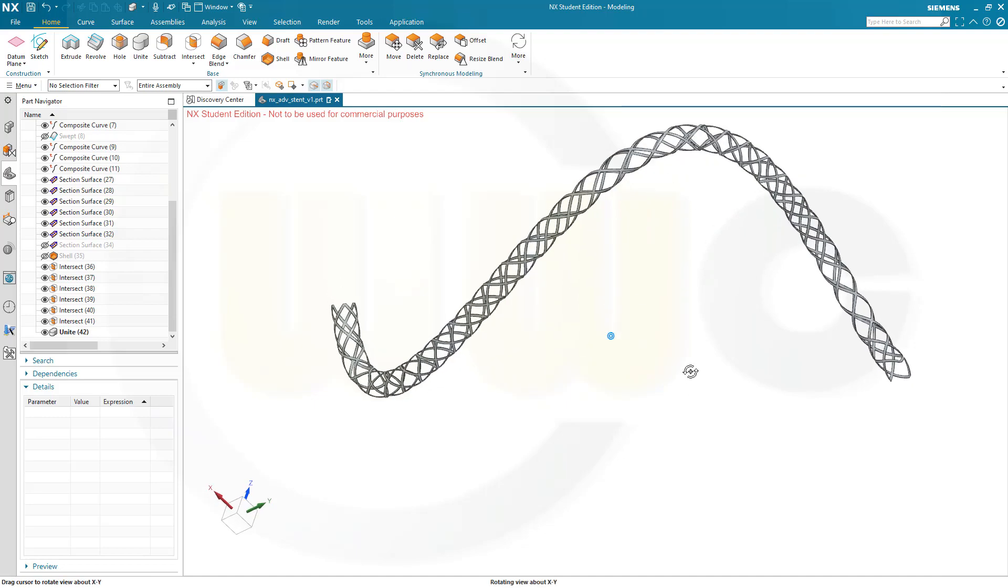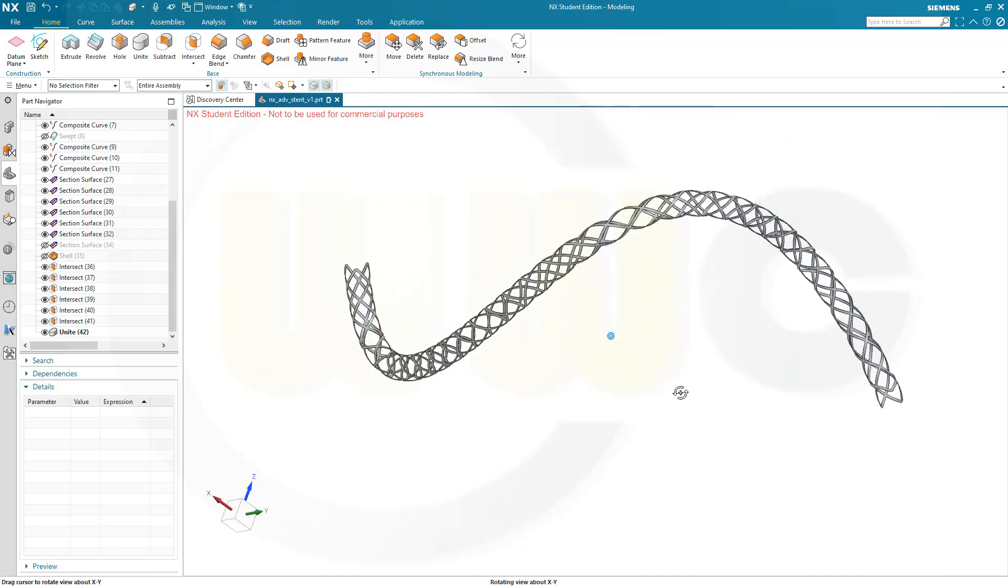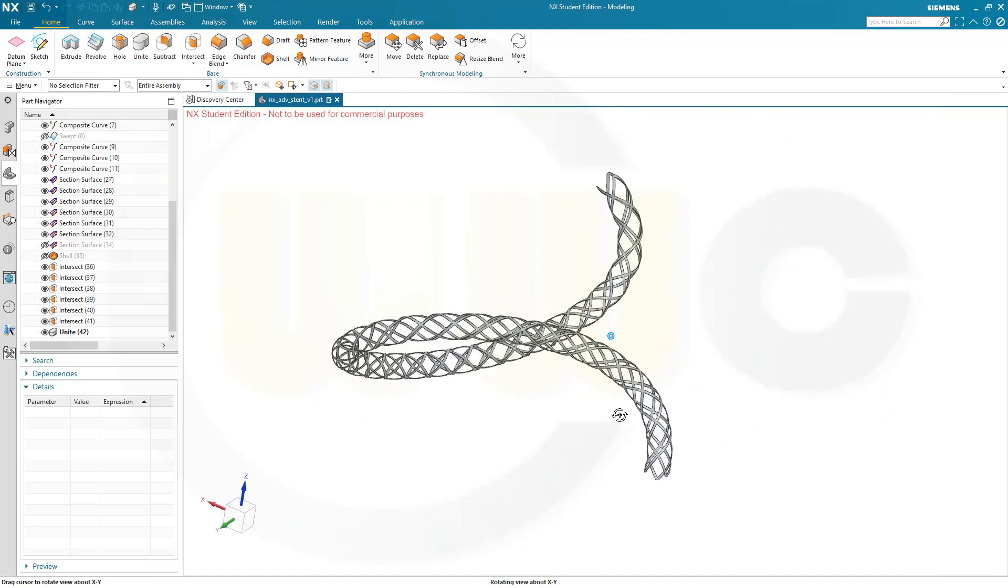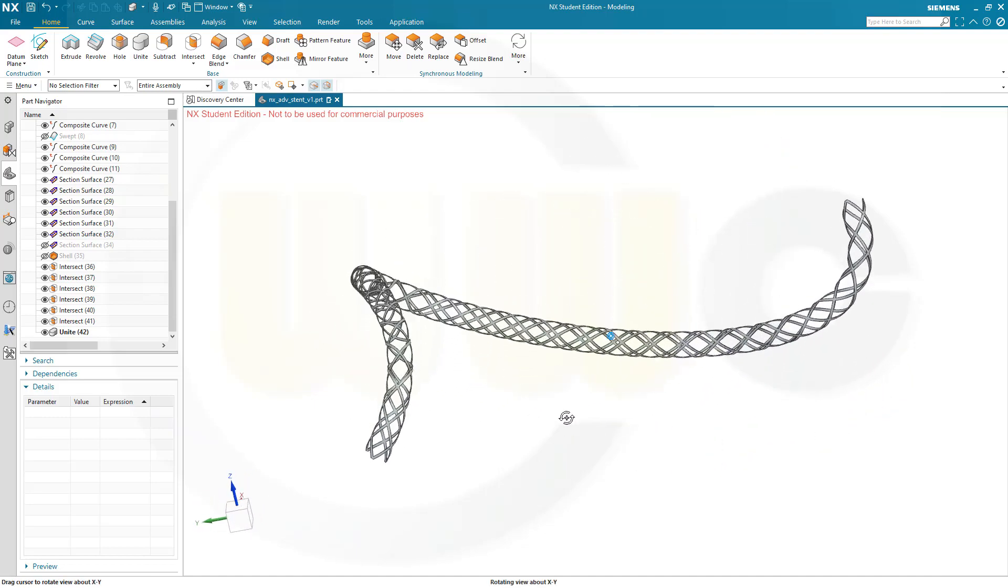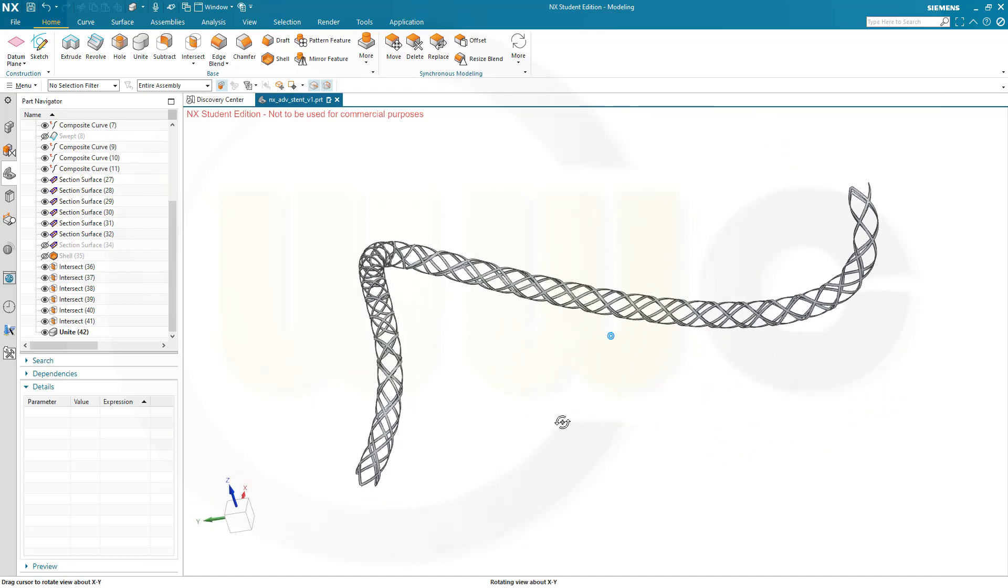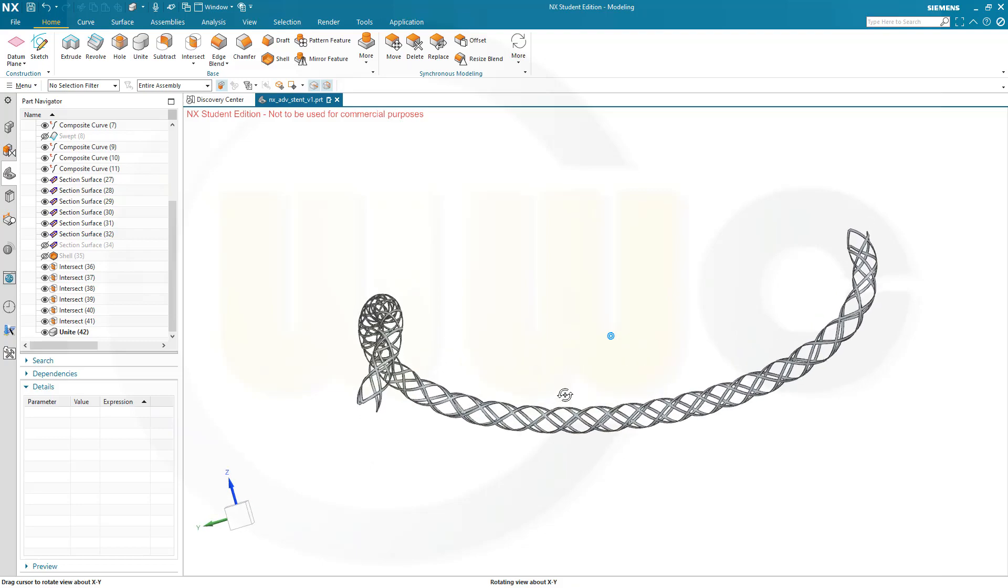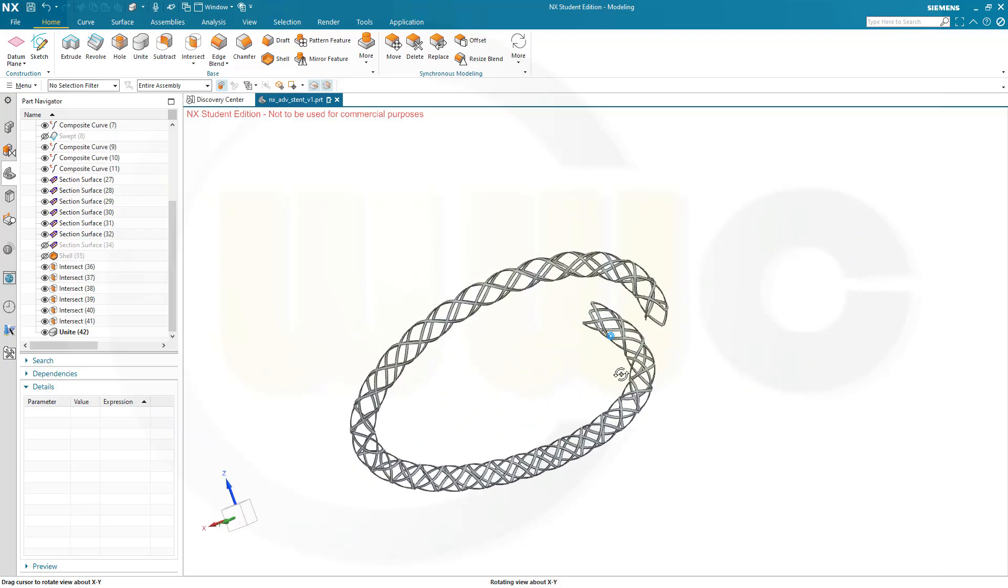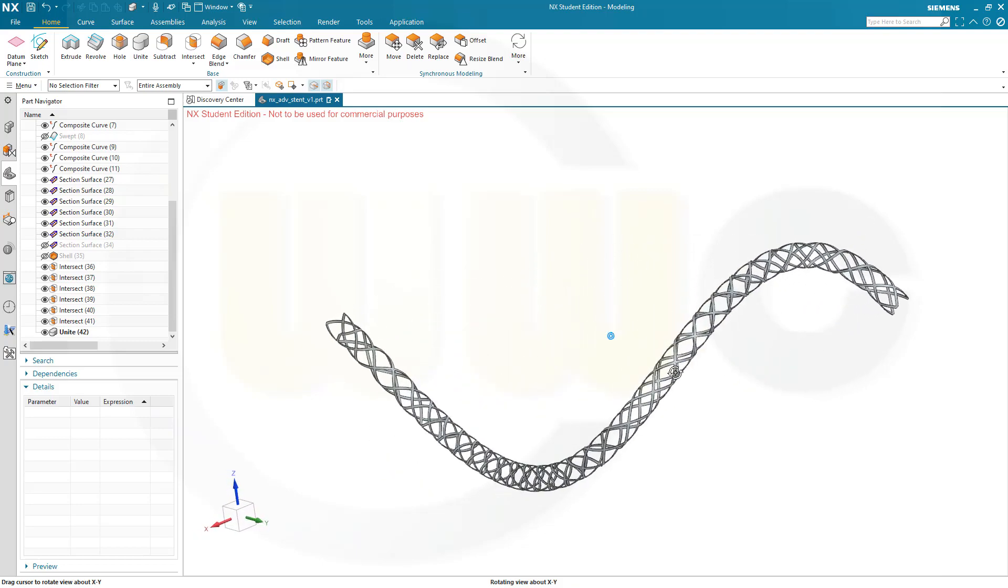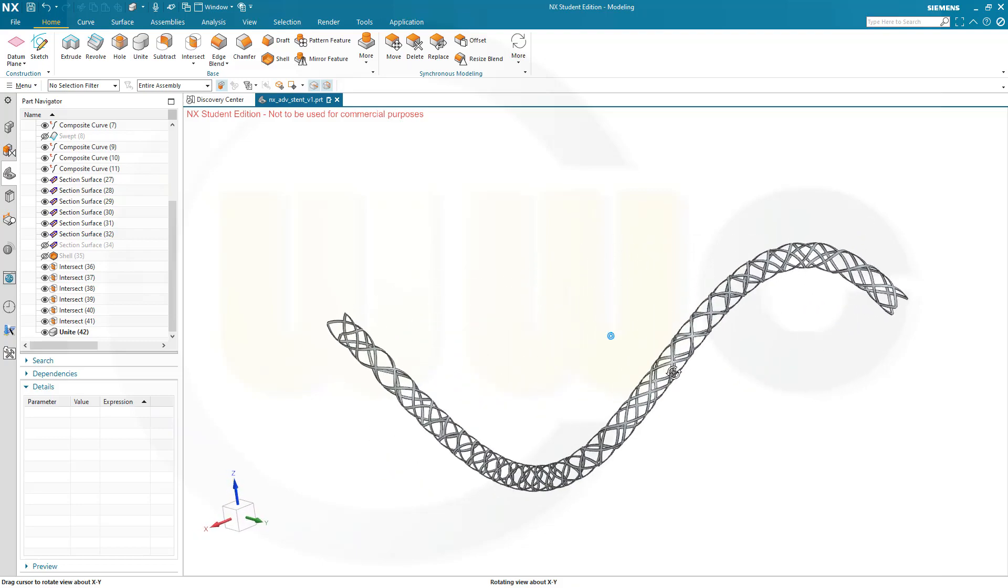Hi, welcome to Siemens NX video tutorial. It's a follow-up to the last one, the advanced stent, now an improved stent.